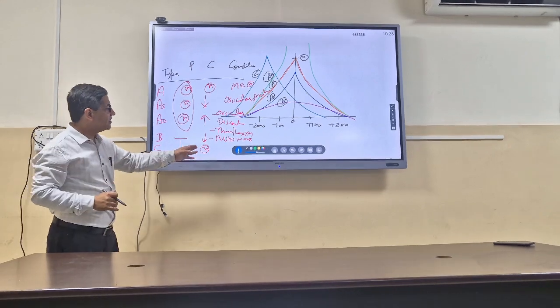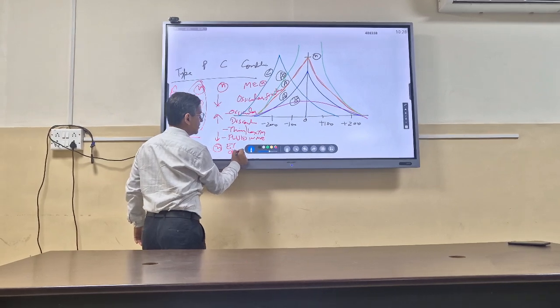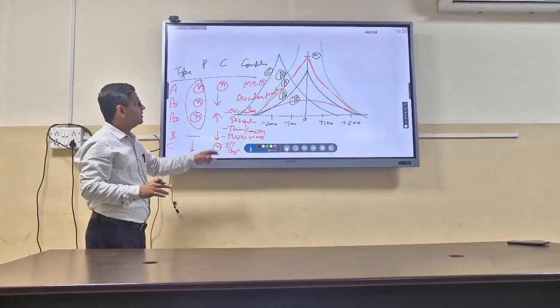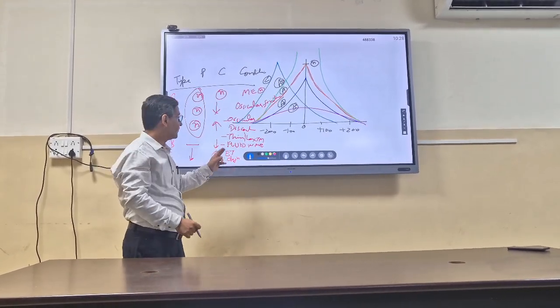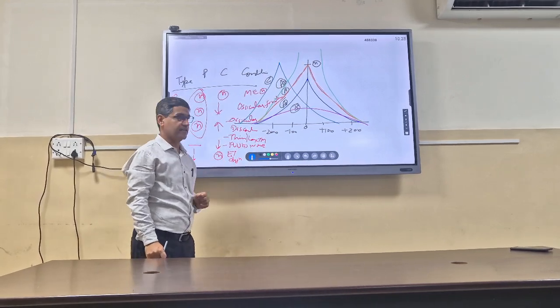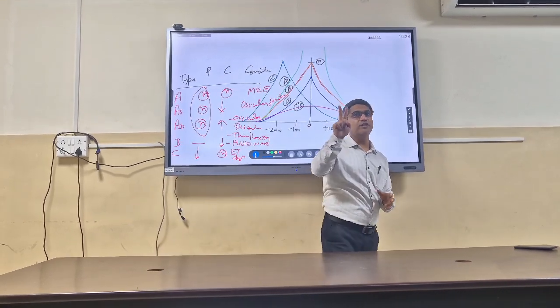Now this is seen in eustachian tube dysfunction. As I told you earlier also, if you consider ossicular fixation, ossicular discontinuity, thin or lax tympanic membrane, fluid in the middle ear, or eustachian tube dysfunction, what is common among all these conditions? There are two things which are common.